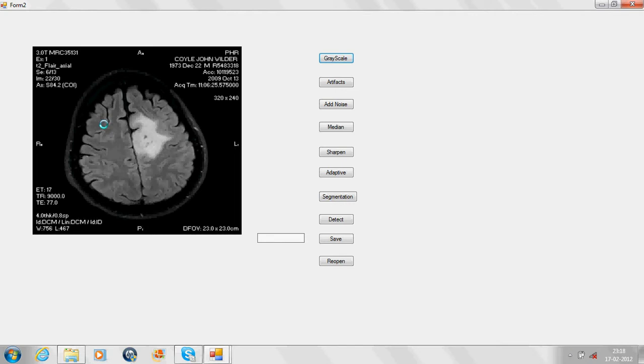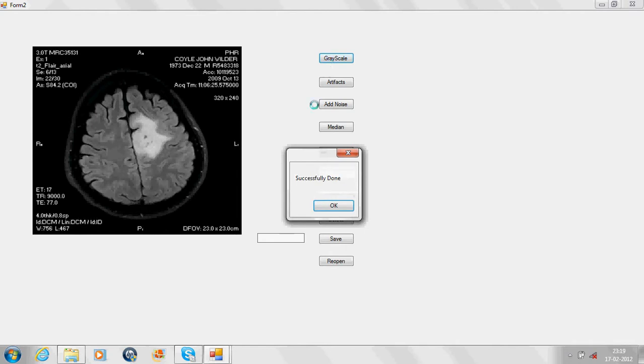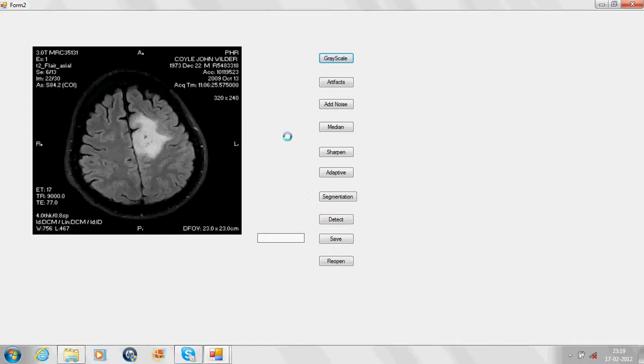Now let us look at the front end. The first two tabs comprise our first module, the preprocessing module. On the click of the grayscale tab, the image will be converted into grayscale. On the click of the artifacts tab, the artifacts such as patient's name, date of birth and other information will be removed.